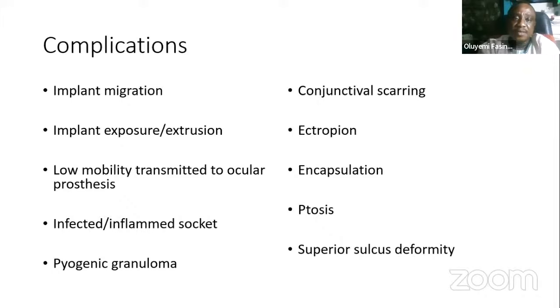Many of the complications of implant placement I've mentioned before: implant migration, implant exposure, and extrusion can occur at any time, from the early postoperative period to the late postoperative period.